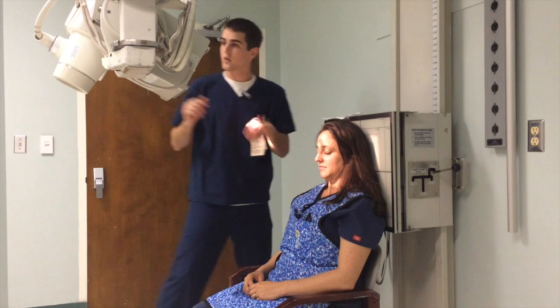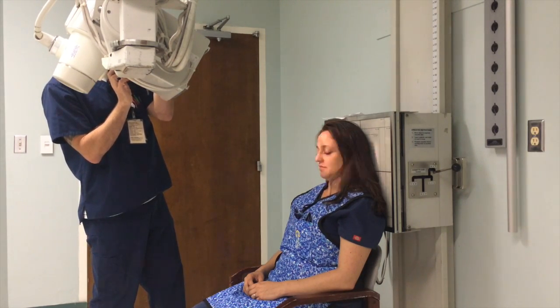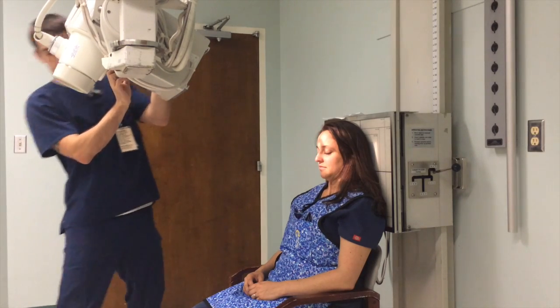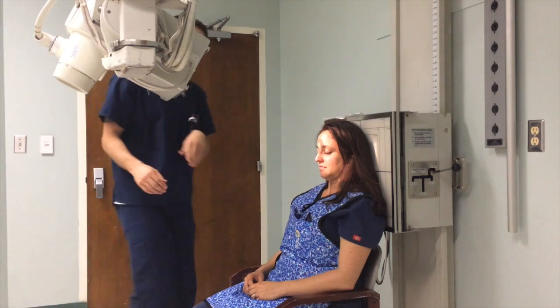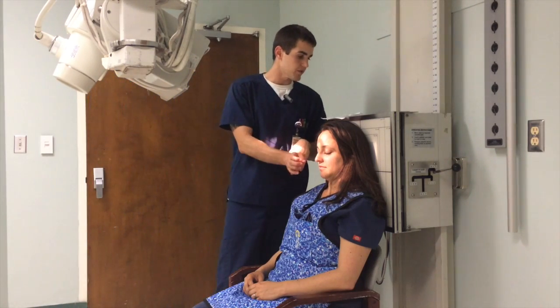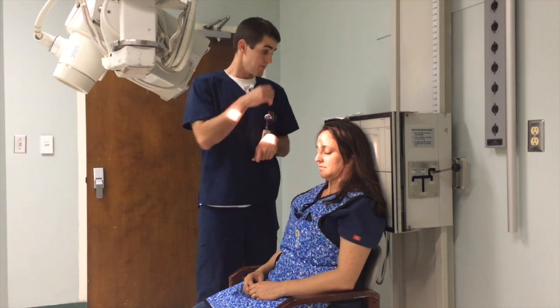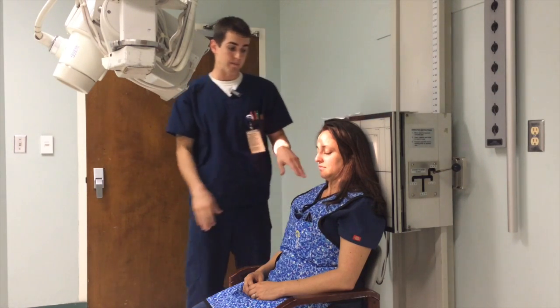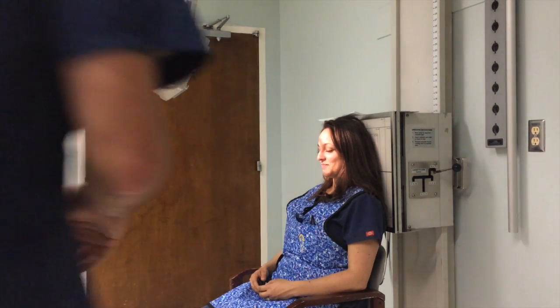Side, come down a little bit. There, careful not to clip off what we're trying to see, which is the zygomatic arches not overlapped by the mandible. So just hold that steady. All right, Marissa, so just stop breathing. Beat. All right, Marissa, so got that one.